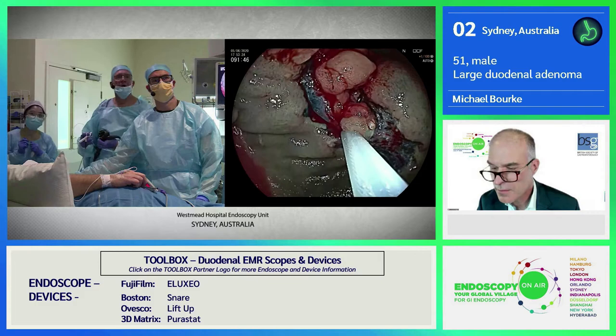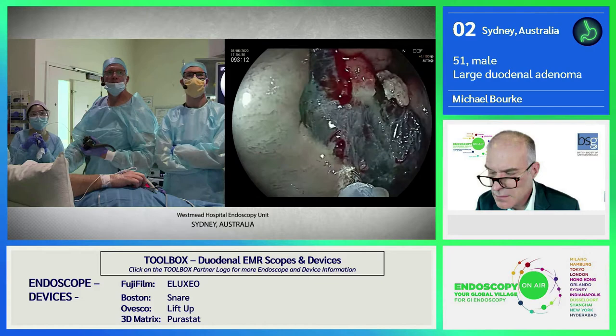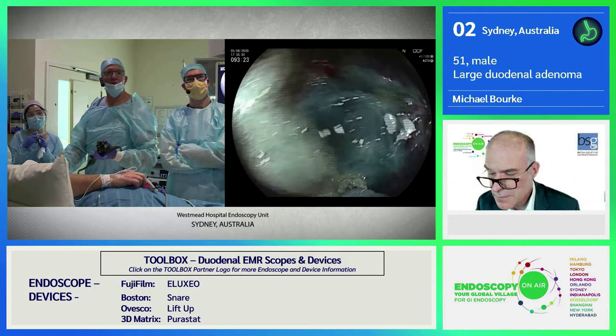So I put my hip against the bed, and I work just with the scope. Now, learning this technique is a good stepping stone to ESD because the movements are very similar. Because you use the snare tip as a wand to paint the margin of the lesion.